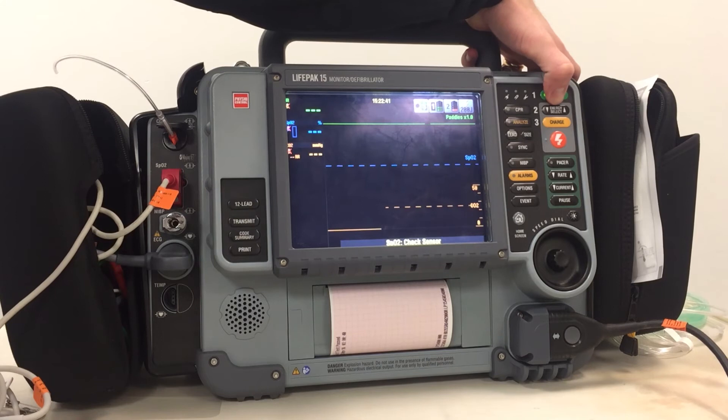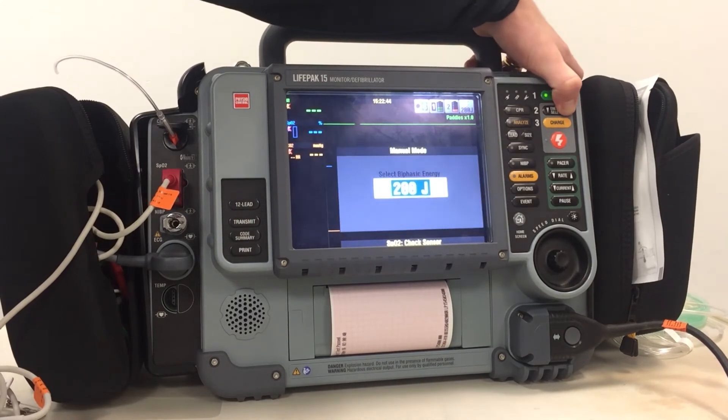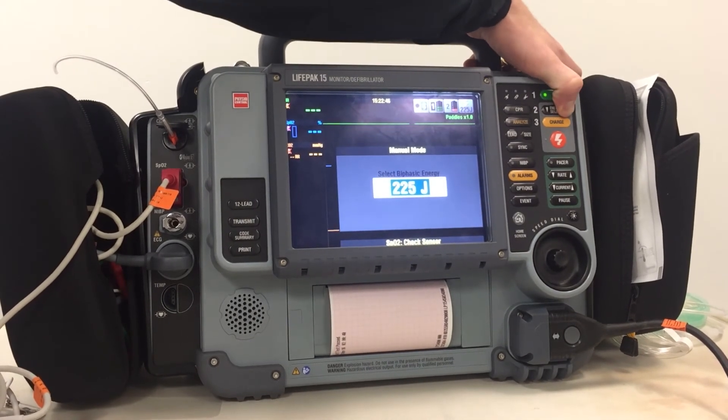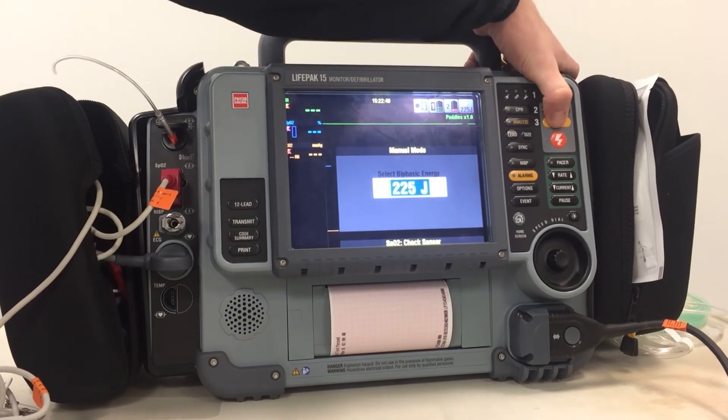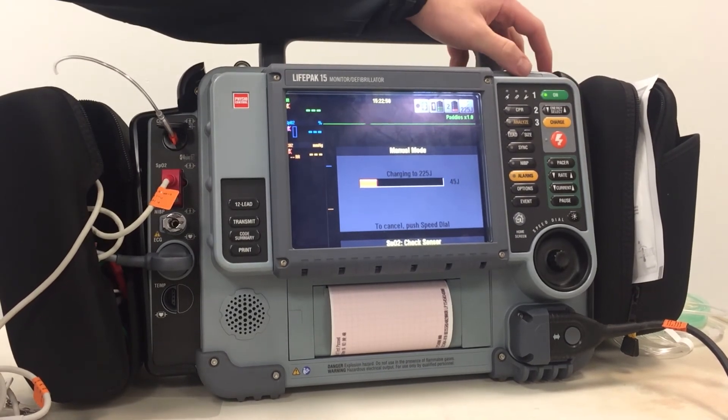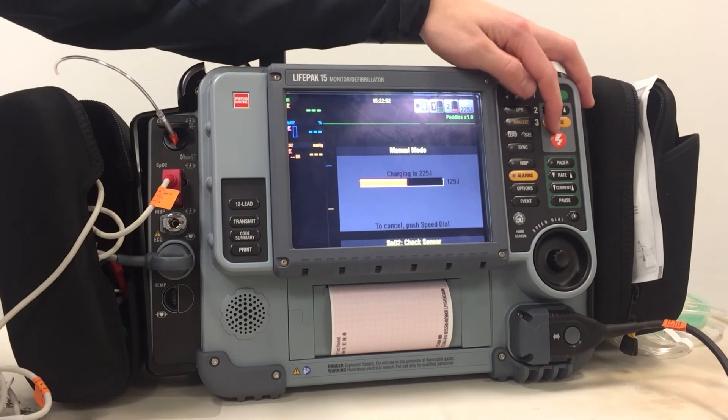To defibrillate, you'll use the energy select button on the upper left to select the number of joules you want to give, then hit charge. To deliver the shock, you hit the orange lightning bolt.